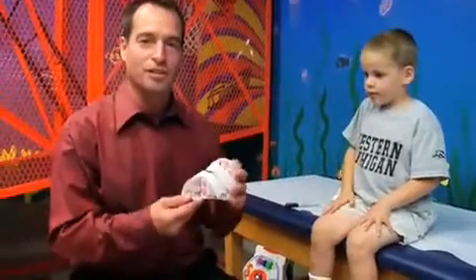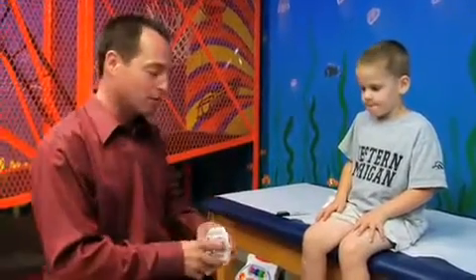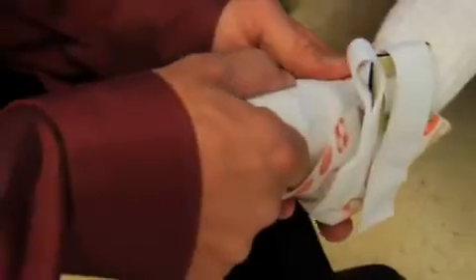When you receive your SureSteps, they should look very much like this and be ready to go on the foot. You want to open them up, and in order to get them on the foot correctly, you just stretch them open and bring them around behind the foot and drop the foot into them. At this point, we want to dorsiflex and supinate the foot — this is an important step to get the heel seated correctly.